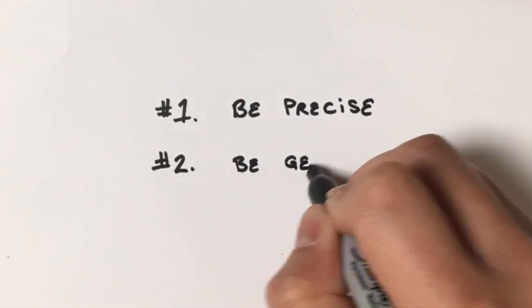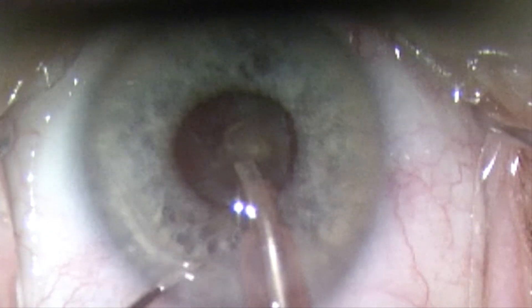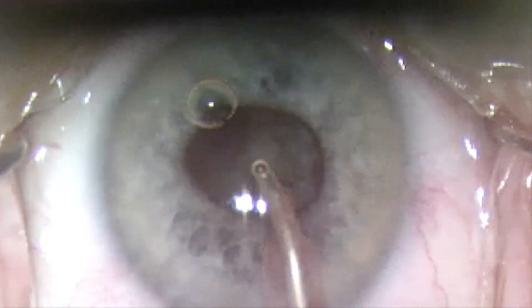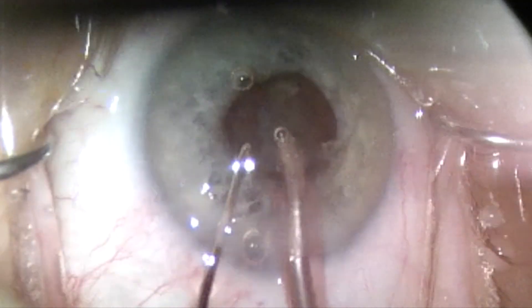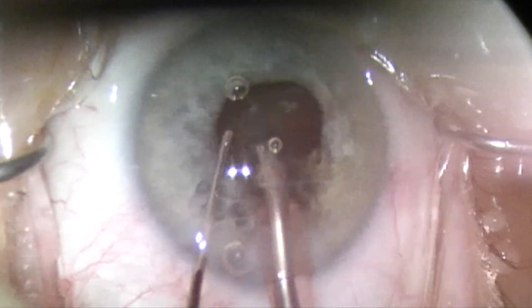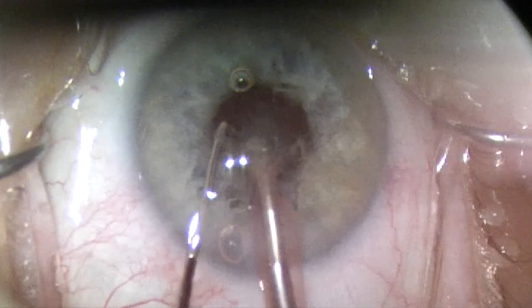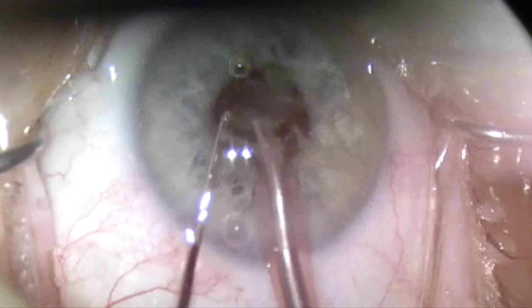Tip number two: Be gentle. Use your second hand with viscoelastic-assisted manipulation of the iris to prevent prolapse. The viscoelastic creates a barrier to separate the iris from the phaco tip. High molecular weight viscoelastics are preferable. Avoid posterior pressure on incisions with your instrumentation — this includes both the primary phaco instrument and the secondary instrument. Any pressure on the incision with your left or right hand will cause egress of your viscoelastic and potentially loss of iris.